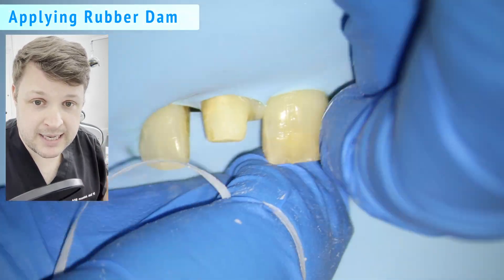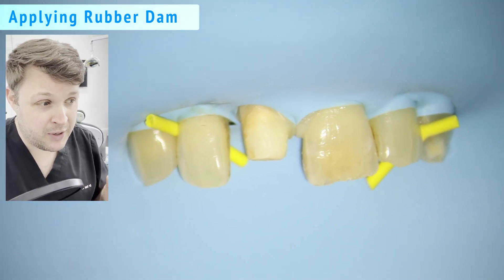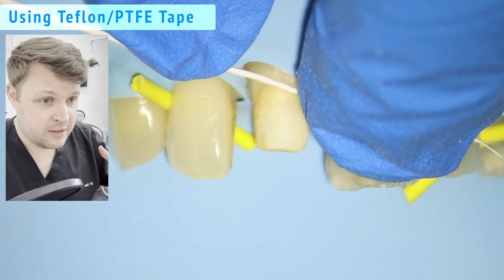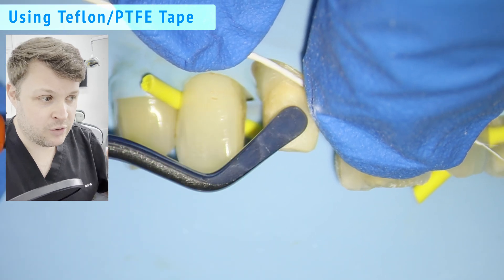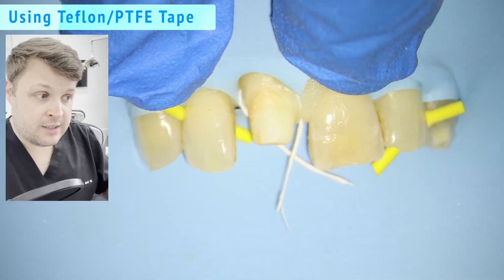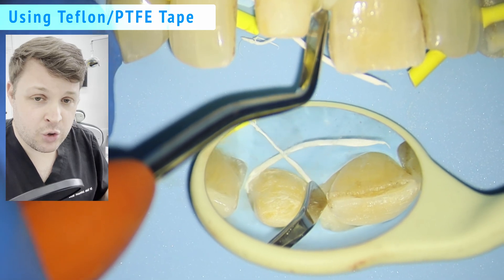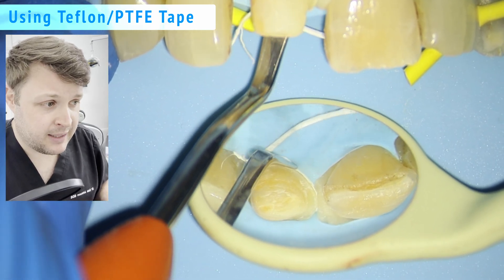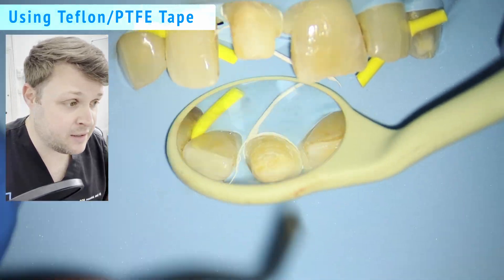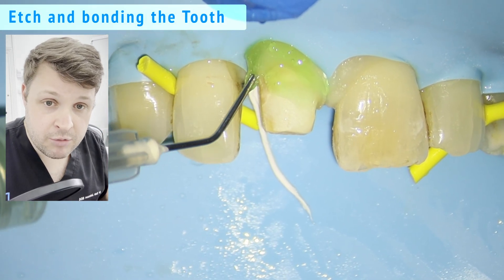Controversially, I'm going to place rubber dam — not a lot of people do this, and I don't do it for every crown. But in this case, because of the blood and saliva, and the crown needing isolation, I'm going to use a little tip: I'm going to use PTFE or Teflon tape, essentially using it like a retraction cord all the way around the rubber dam.